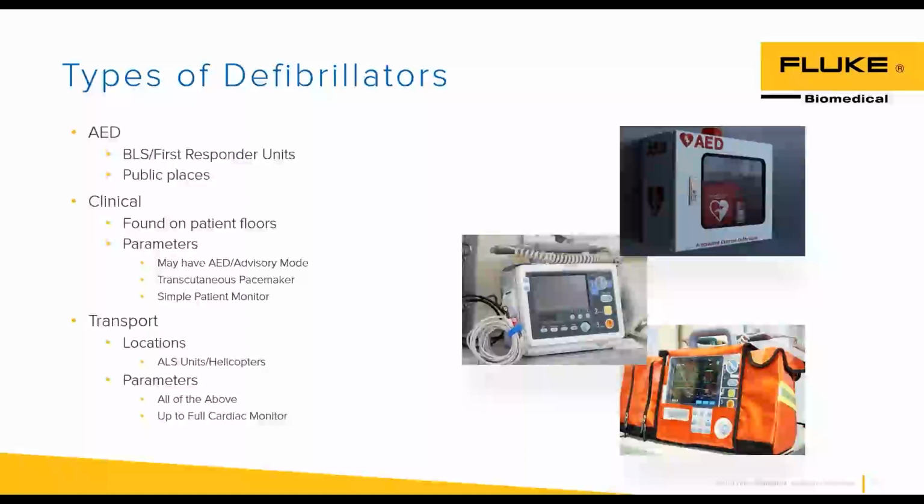Clinical defibrillators are going to be more found on patient floors. Typically, these have more features built into them as they're used by trained personnel. And these are going to have maybe more parameters on them, being able to do pacing and maybe checking more parameters, like SpO2, ECG, NIBP. So they're going to have kind of a patient monitor built into them.